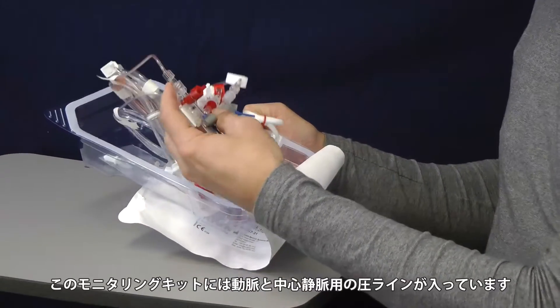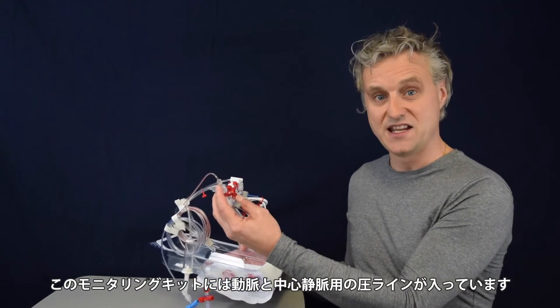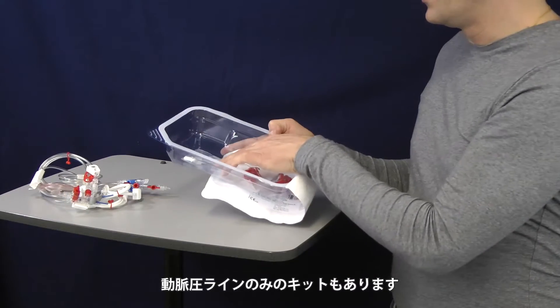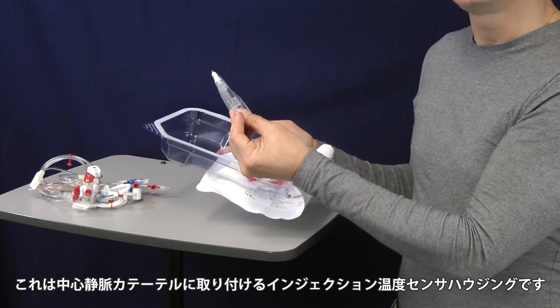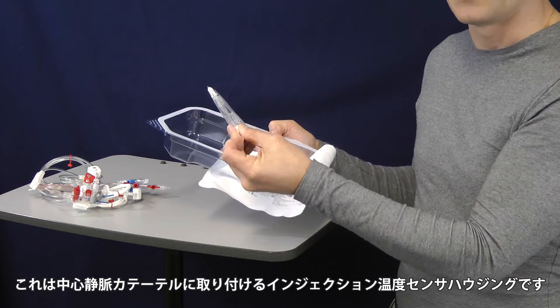Here you can find the tube pressure transducer which can be connected to the Pico catheter and the central venous line. Separately sealed is the injectate sensor housing. You will need this for the connection to the central venous pressure line.